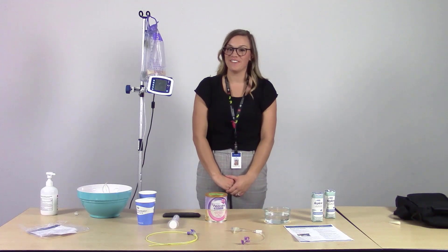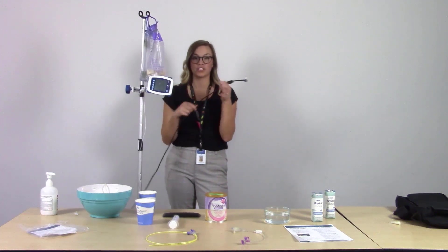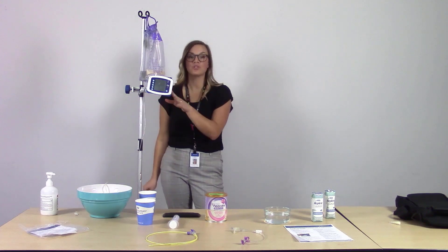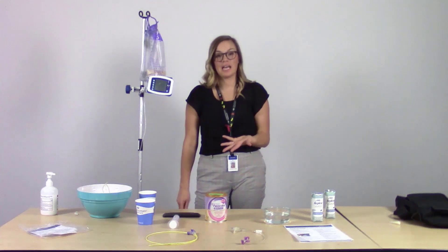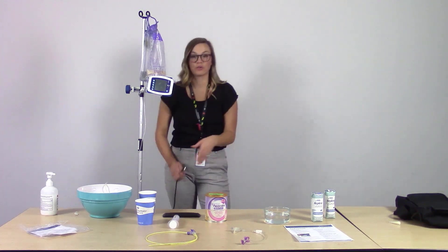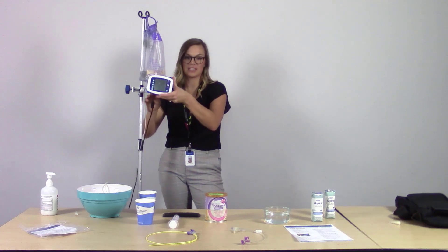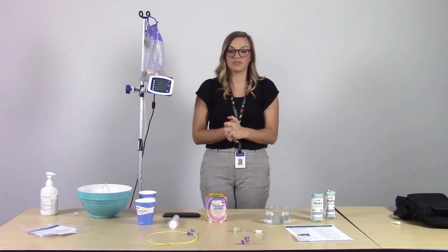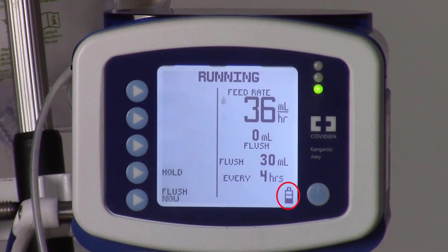In terms of charging the Joey Pump, it comes with a charging cable. Once unplugged, the pump relies solely on battery power, with a battery life of 18 hours on a full charge. To recharge, simply take the charging cable, plug it into the back until you hear a click, and it will charge. When fully charged, it will show a battery symbol with a fully black fill in the corner.